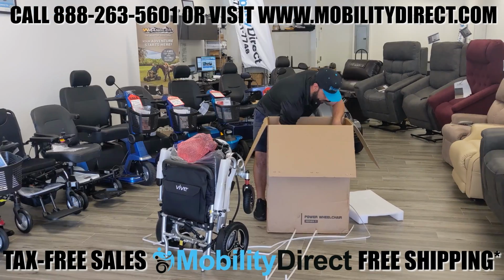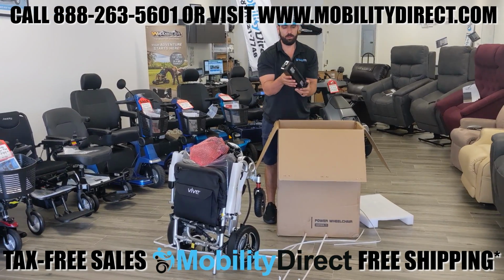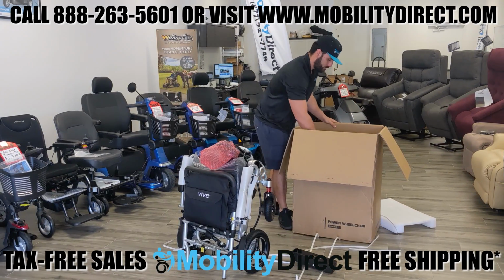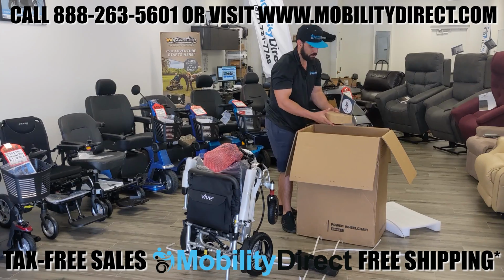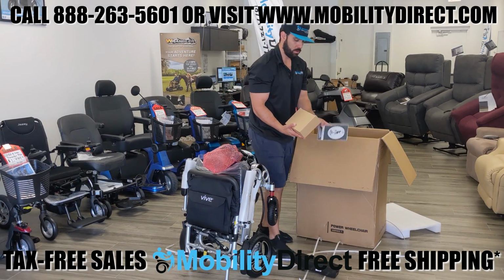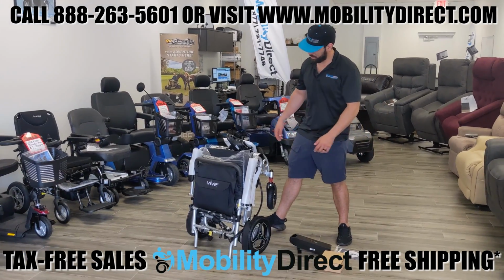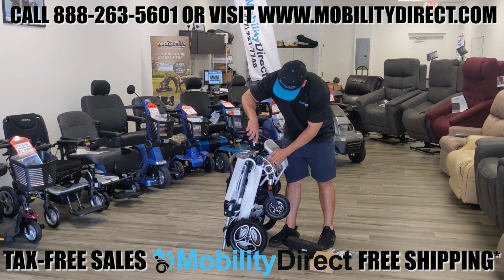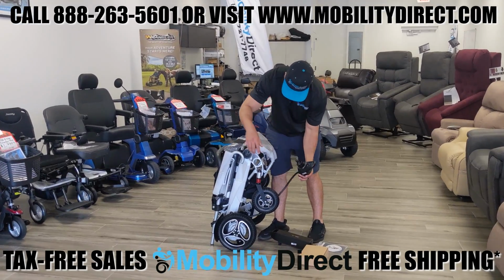Typically, you will find the joystick in a box, but if it comes unpackaged, it's okay. Just be very careful and rest it on the top of the chair, and go ahead and grab the rest of the components out of the box, including the battery pack and the user manual and the charger, which comes in a box. The first thing you want to do is get ready to unfold the chair so that we can mount the joystick properly.